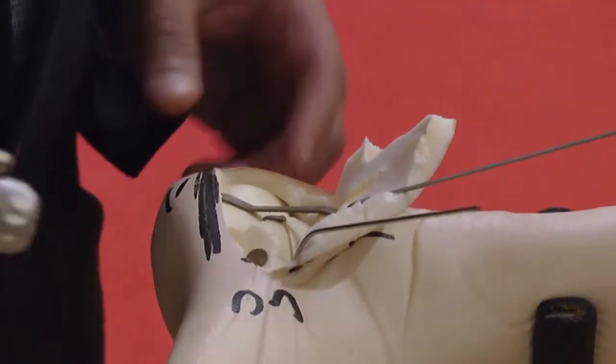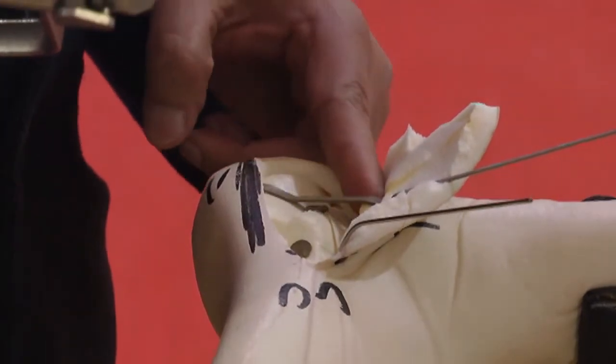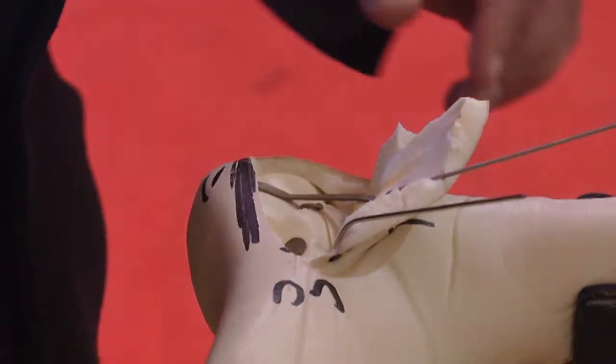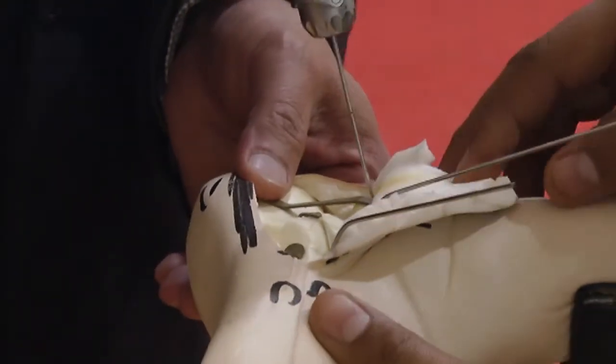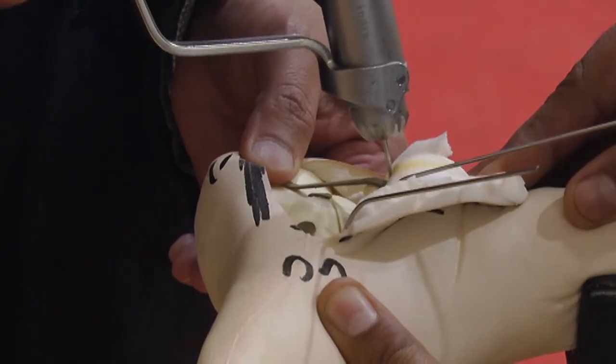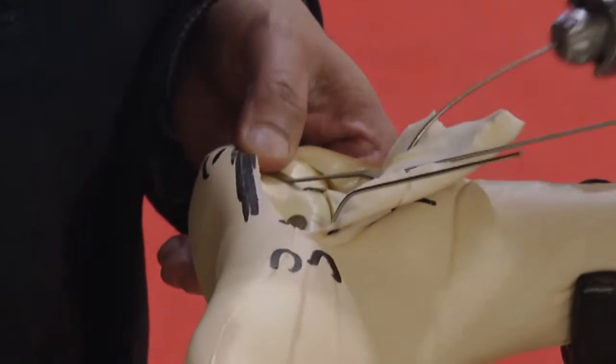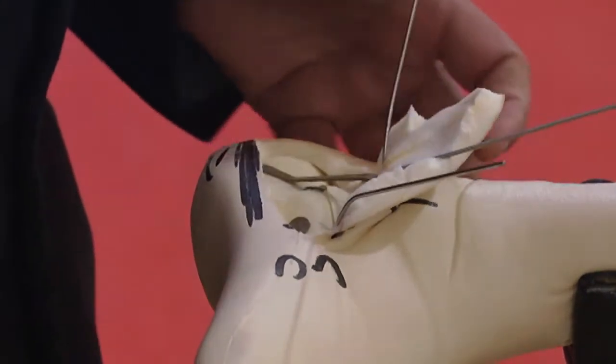And then we are not going to put a third wire, but if you want, you can put a third wire into the posterior tip of the fibula, or maybe into the back of the talus there, just posterior to the fibula. So that exposes your lateral surface as well as the subtalar joint.